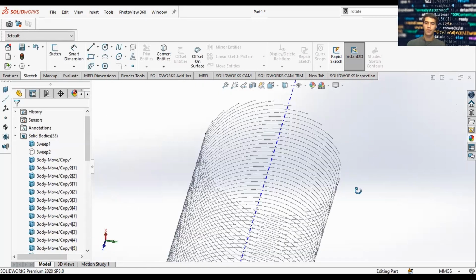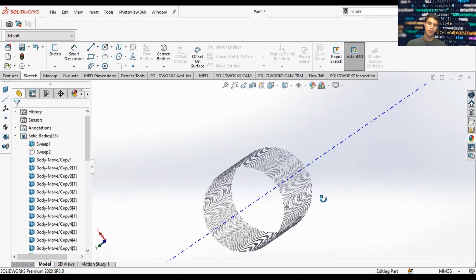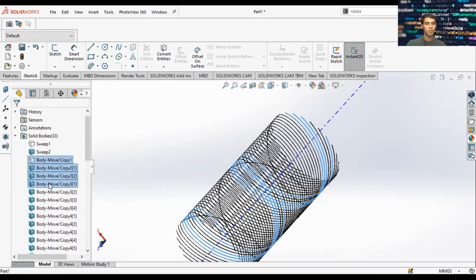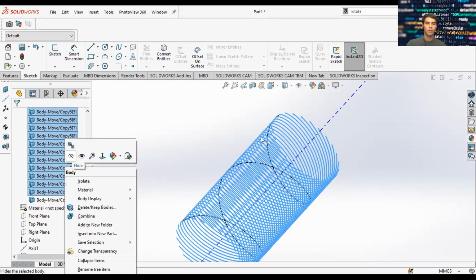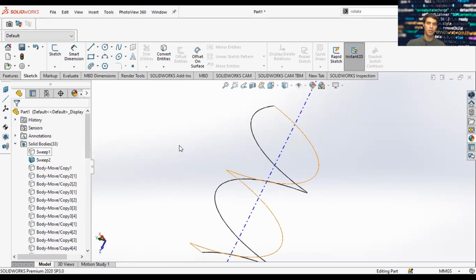There you go. So we have a uniform strand, in this case going in one orientation. So we'll go ahead and now worry about the other half. Let's go ahead and hide all of this and bring this one, or sweep 2, and hide the rest. So they're hidden. And now we have the sweep number 2, which is in the opposite orientation from sweep number 1.